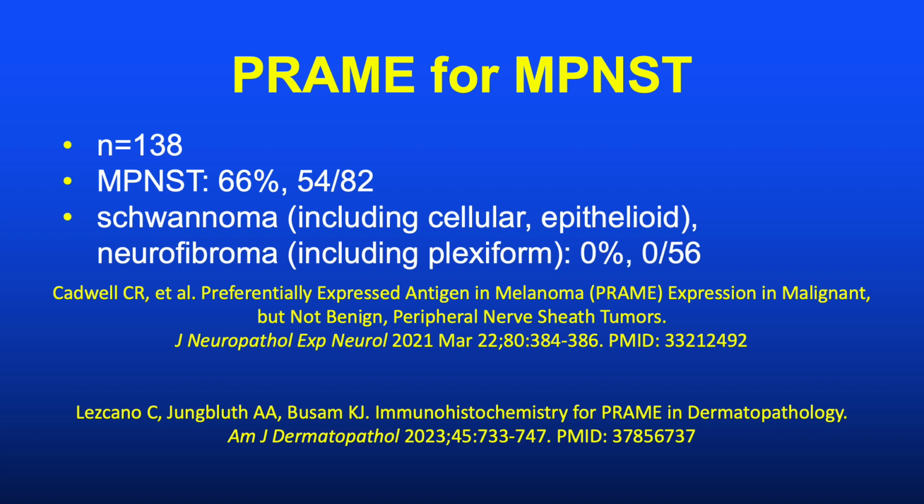Now, my sense is that most laboratories in the United States do have PRAME, preferentially expressed antigen in melanoma, which we now know is not only diagnostically useful in nevus versus melanoma, but also in other areas, including MPNST as an ancillary diagnostic marker.